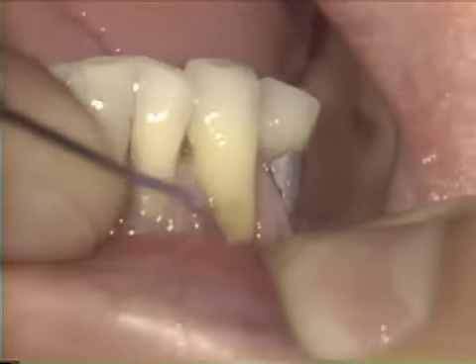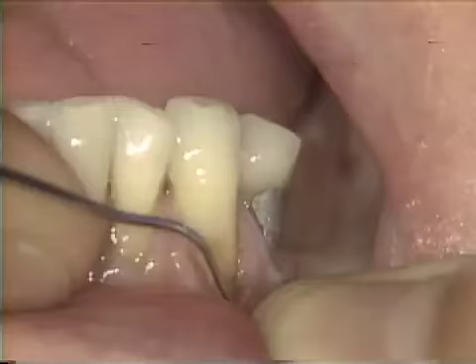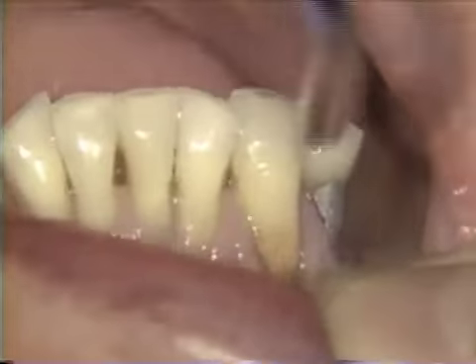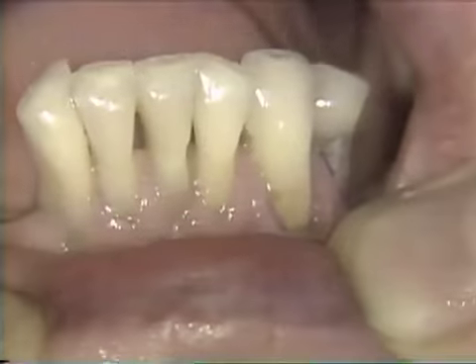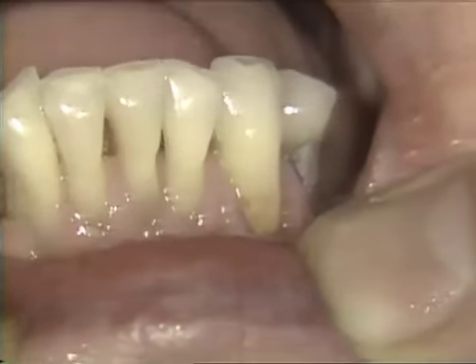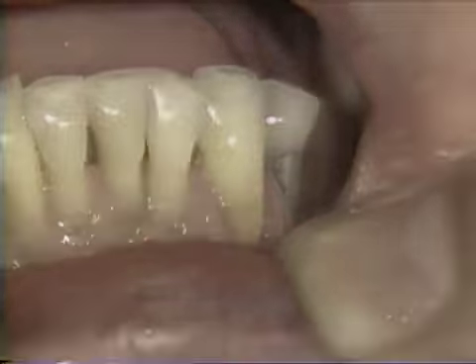The final restoration has the advantage of glass ionomer caries protection at the cervical, where traditionally the Class 5 restoration has failed due to recurrent caries. The restoration with the highest failure rate in restorative prosthodontics has been improved aesthetically and in caries protection.